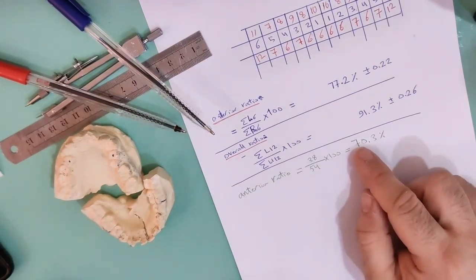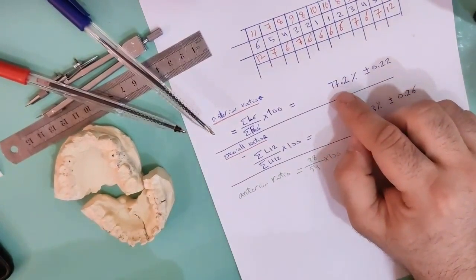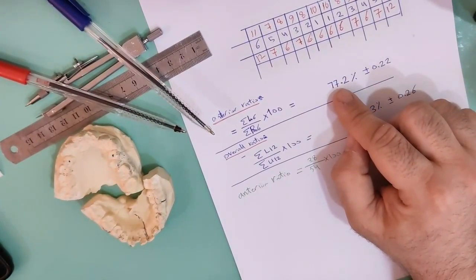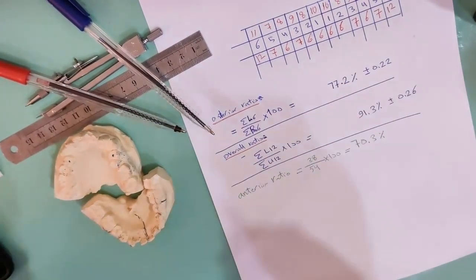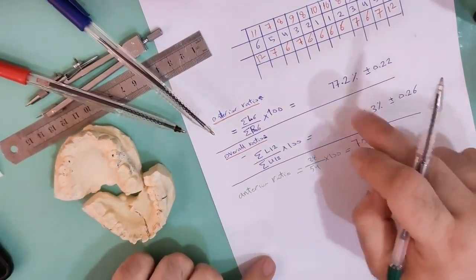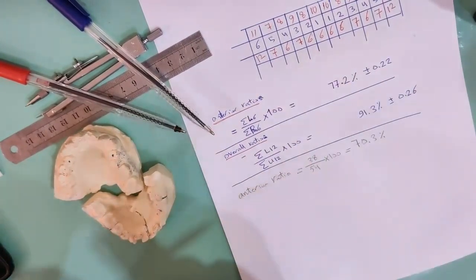Here we have 70.3 and the reference is 77.2, so it's less than 77.2. So we know the problem is in the maxilla.